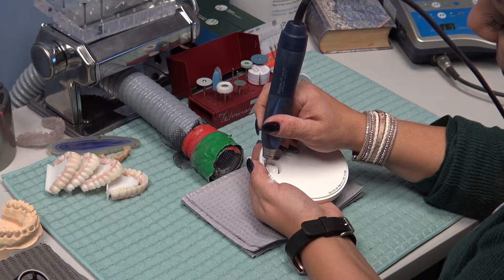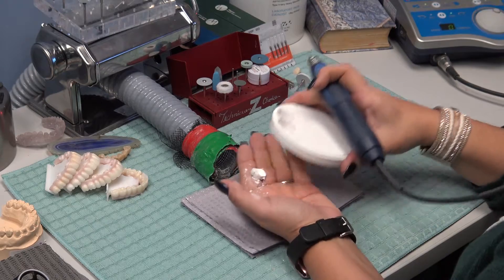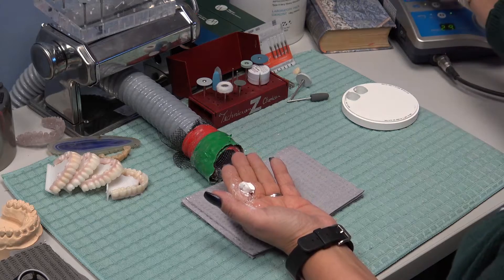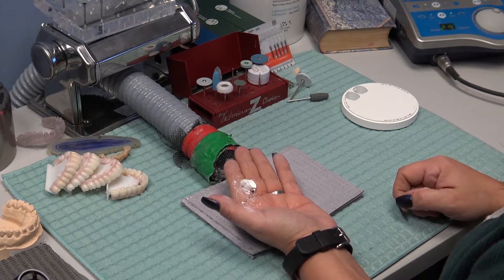Cut through the rest of the sprue, and when the crown does fall out, it'll fall on the occlusal surface and not on the margin. That just gives you a little bit of extra safety when cutting the crown out so it doesn't fall and accidentally chip a margin.